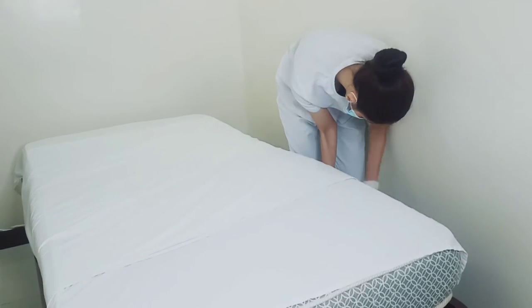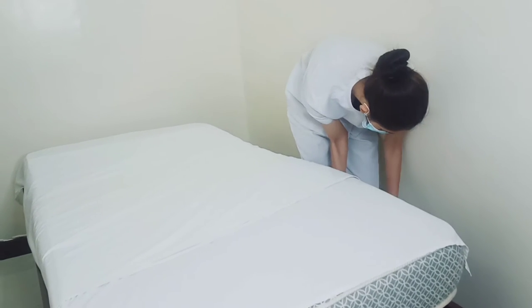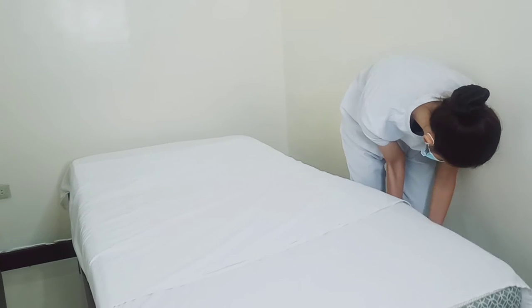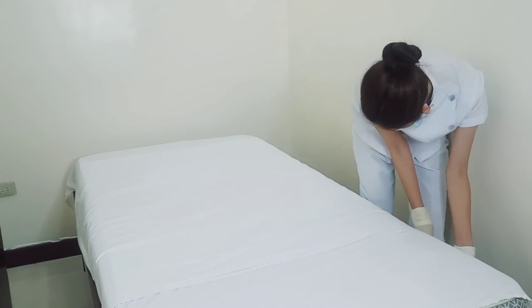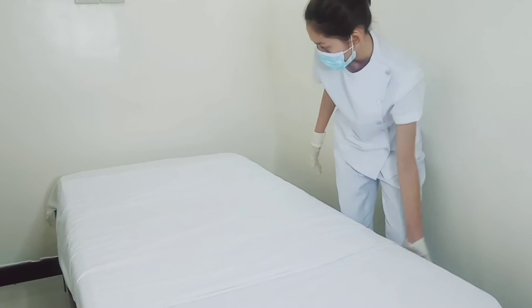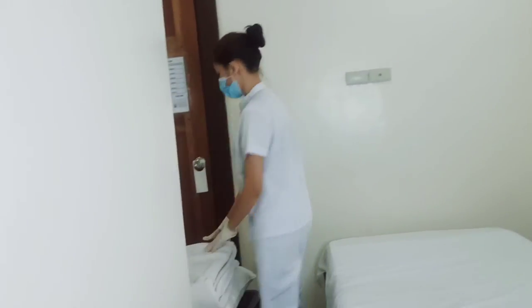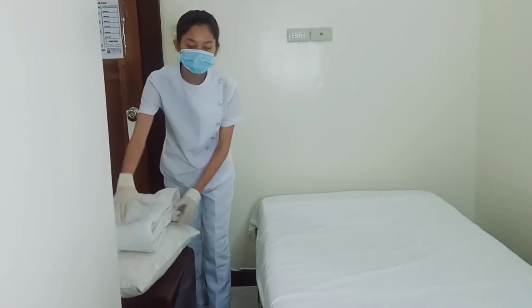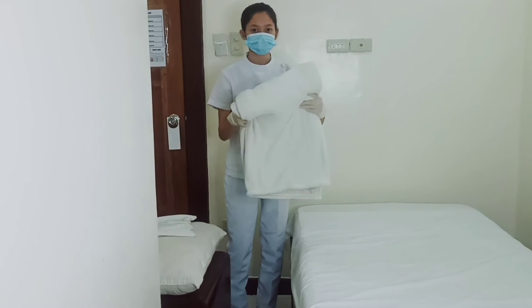After dressing all the linens, we're going to tuck all the linens under the bed. Make sure that your palm is facing down under the bed. After dressing all the linens — which is the bottom sheet, rubber sheet, and the cotton draw sheet — we're going to place the top sheet.